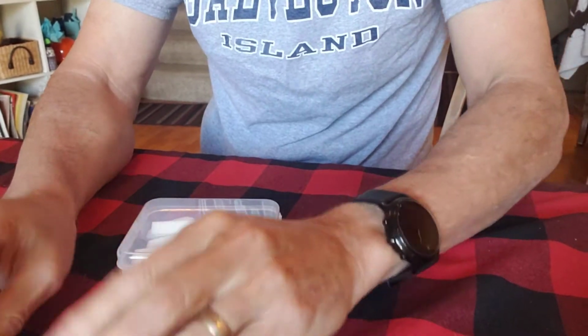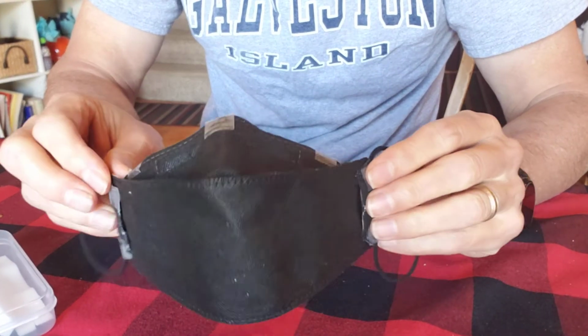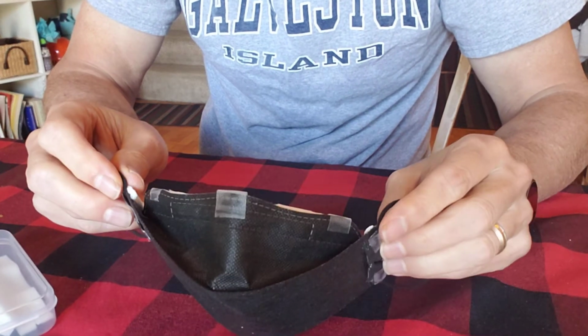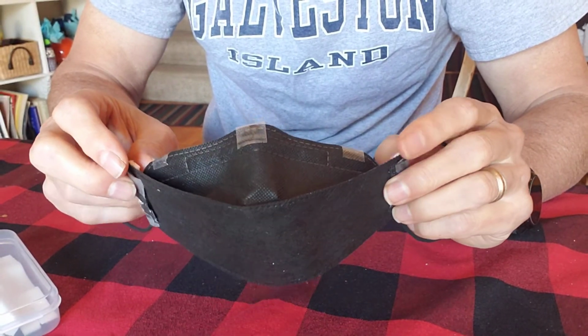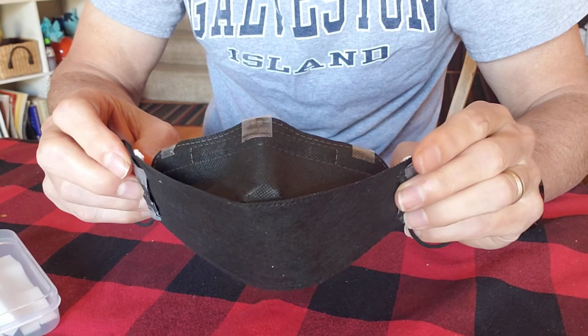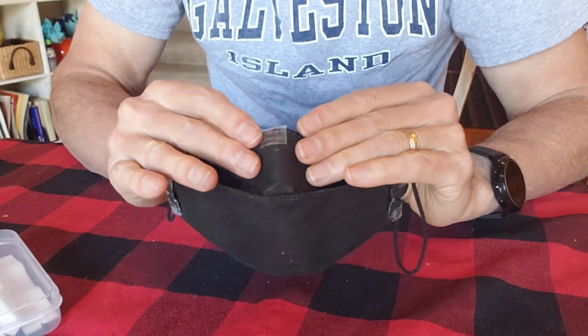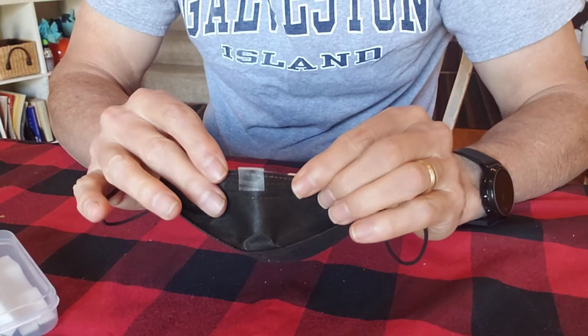And the last thing I'll say is, of course you do a fit check when you put this on. What I do is put it on and I give 2 quick puffs of air, and then check to see if I can feel it in my eyes or hear it in my ears. And if it doesn't work, I'll put my finger over it to try it again, to compare with and without pushing it to my face.